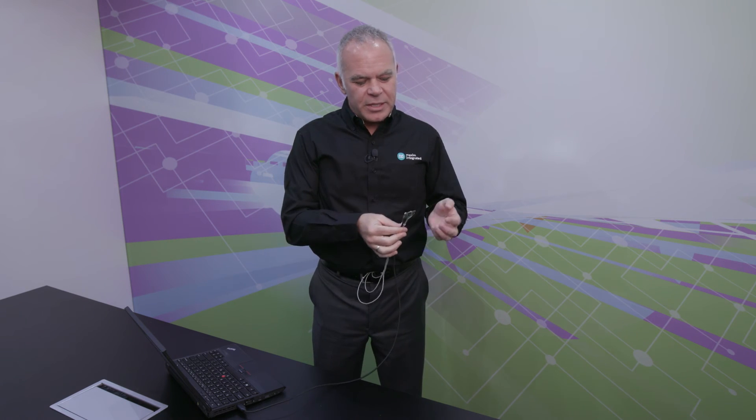The kit also includes a debugger board which plugs into the main board. The debugger board allows you to plug into a PC and download new firmware to enable new use cases.